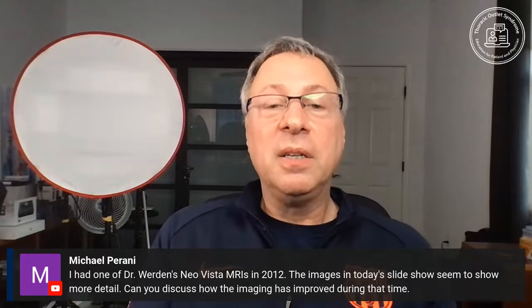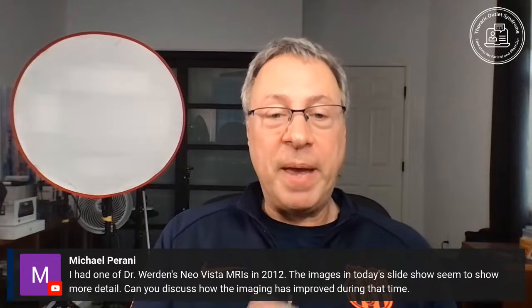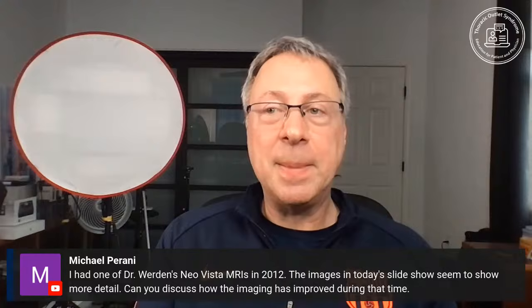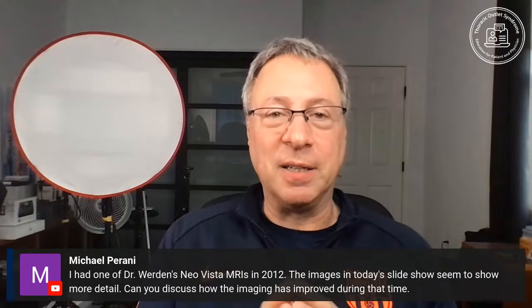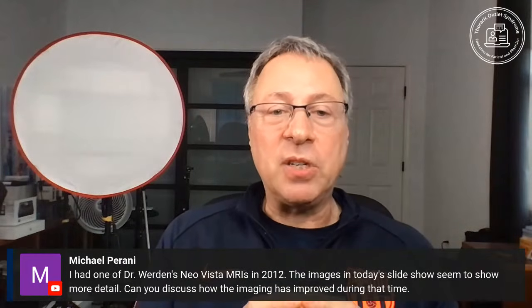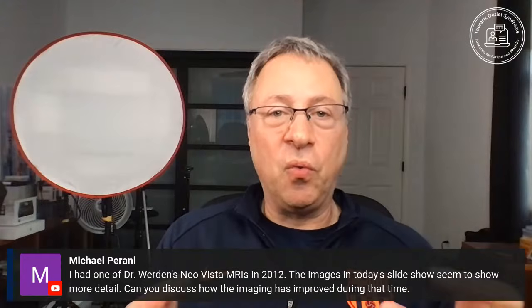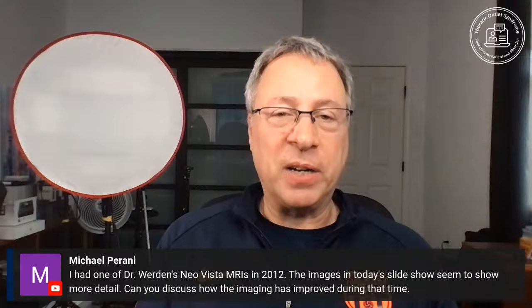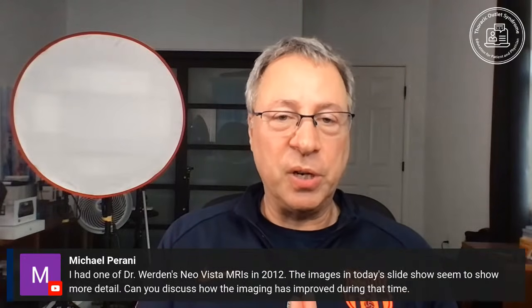Thank you, Michael. The refinements we made over time, without getting too technical, are in the image scanners. We've worked with our partners to change the amount of time for each sequence, which allows us to get higher resolution.